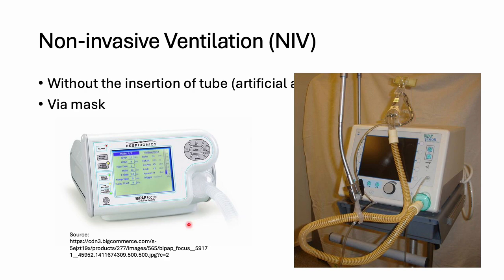Okay, and these are some of the machines that you might see. So machines like this can only be used for non-invasive ventilation. They cannot be used for invasive ventilation. Okay, for invasive ventilation, you need those machines that I've shown you in the first part of the lecture.